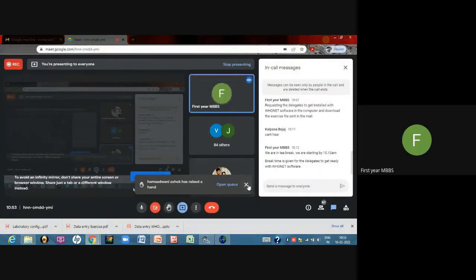Thank you so much, ma'am. Ma'am, will you lead us through the hands-on practice? Now, shall we start now itself? Yes, ma'am. Okay. So everyone is ready with the installation? Yes, ready. Shall we start?